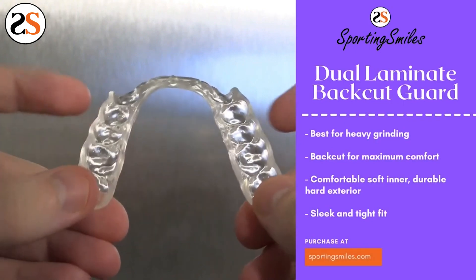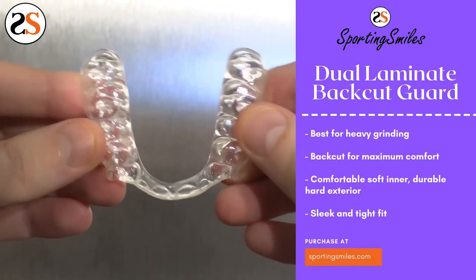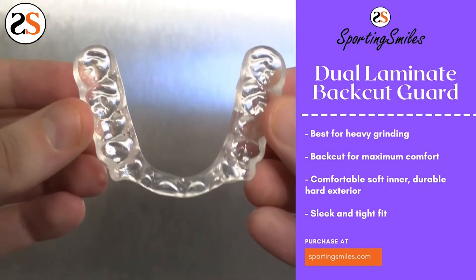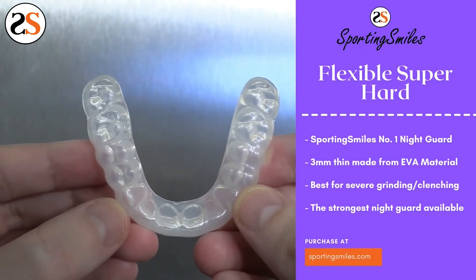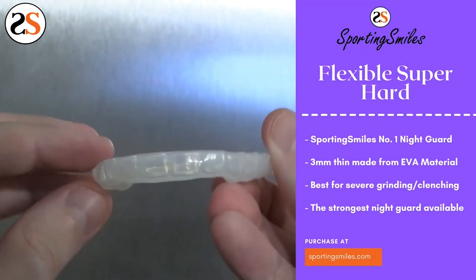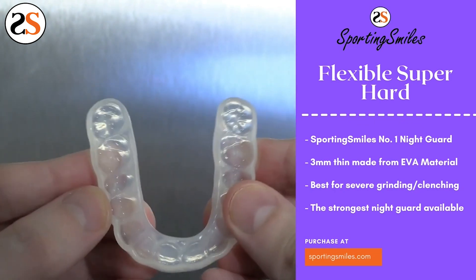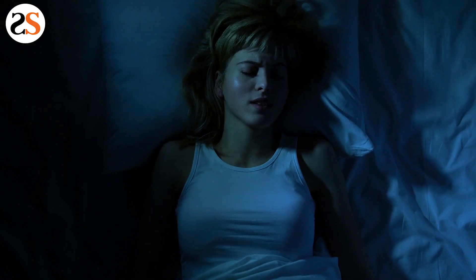Even if the term bite splint is old fashioned, the device is top of the line. So what is a bite splint? It is an interchangeable term for night guard, teeth grinding guard, sleep guard, and many other names — but they are all devices that protect you from teeth grinding and clenching. They are designed to prevent teeth grinding and protect your teeth long term against the dangerous habit caused by stress and anxiety.